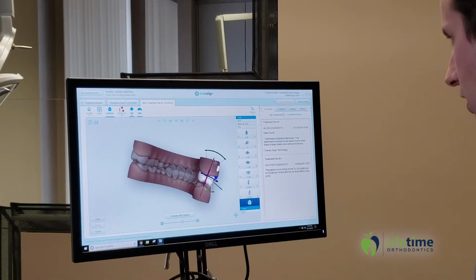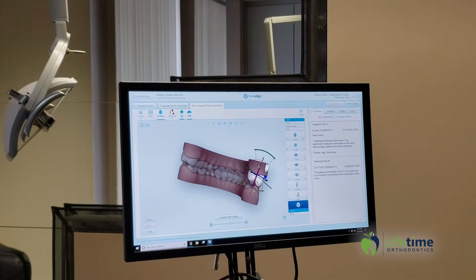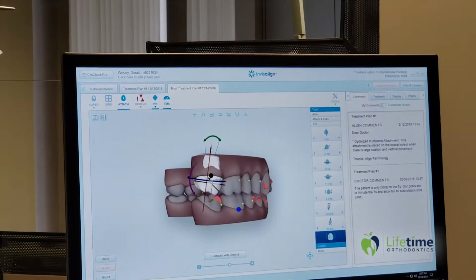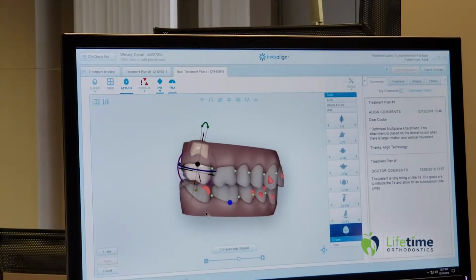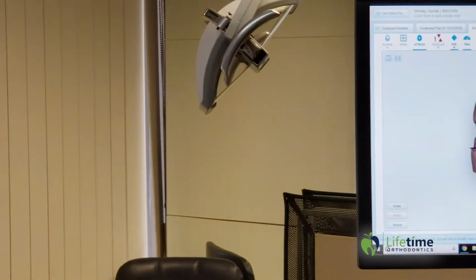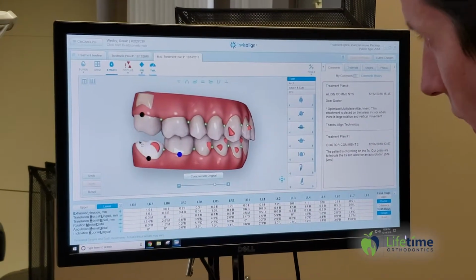And then I want to lift this up maybe about 2 millimeters. I don't want this tooth to be in contact at all, because I want to relieve that contact on the back, okay? Same thing on the bottom. I'm going to drag this tooth down, maybe about another 2 millimeters. Okay, so what I'm trying to do is just get these teeth out of contact right now.